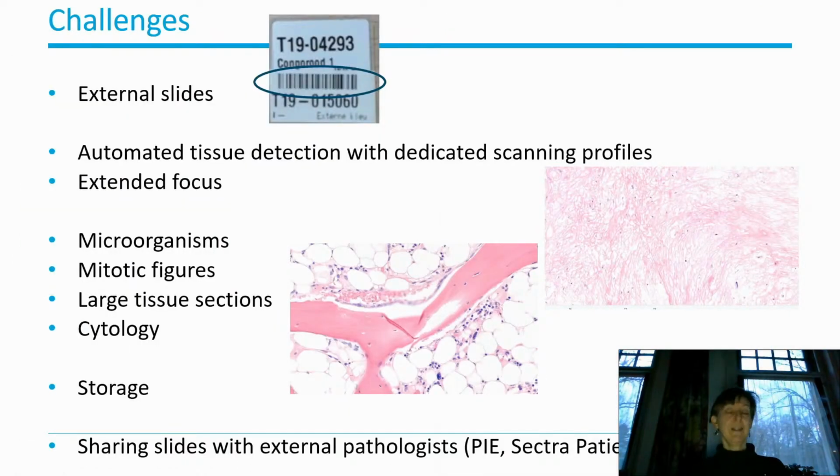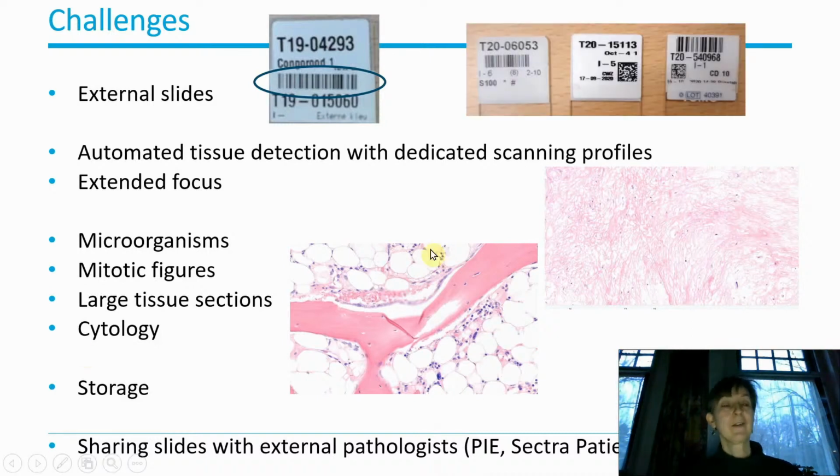Okay, of course, there are still challenges that we have to overcome. And one of them is the consultation cases, because they all have their own barcodes and different labels. And now we are developing labels that we can easily stick over these different labels, so that we still have the information that we need, but the barcodes don't interfere with ours.